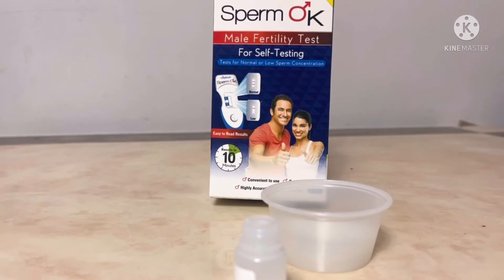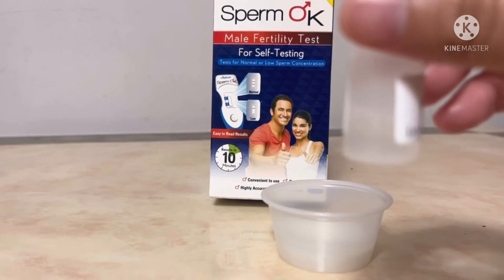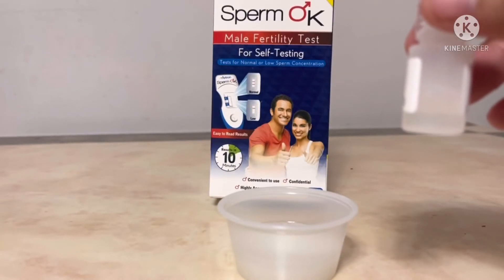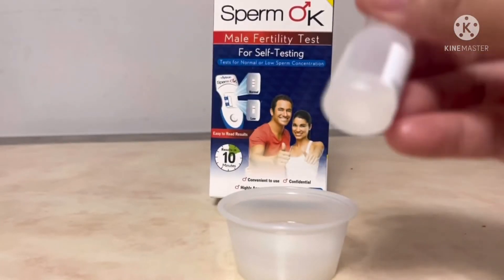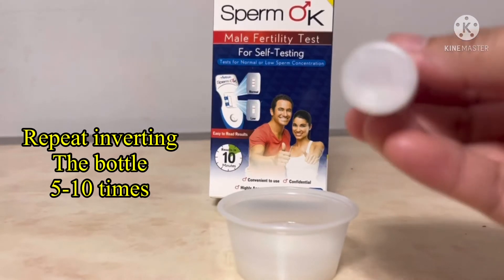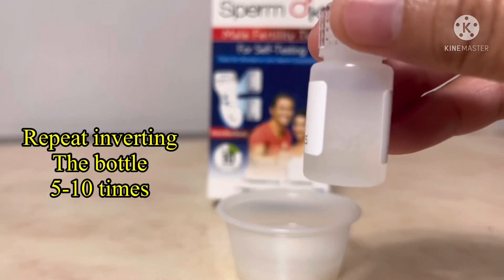Allow this to stay for 2 minutes — just allow the solution to soak. Don't shake the solution and the sample. What you can do is just invert the bottle like this: 1, 2, 3, 4, 5. Or if you see that it's still thick, just do it 10 times.